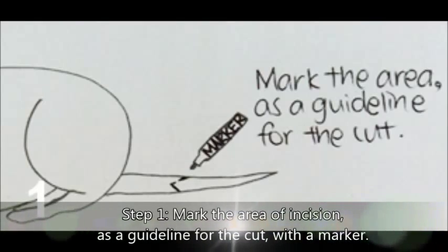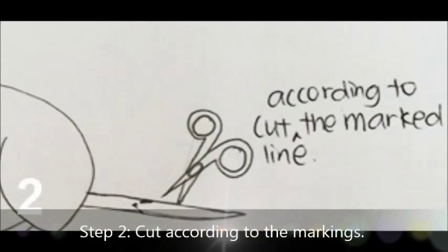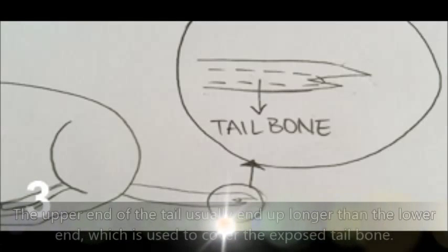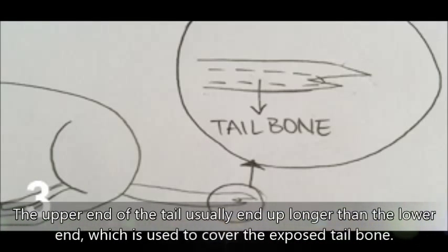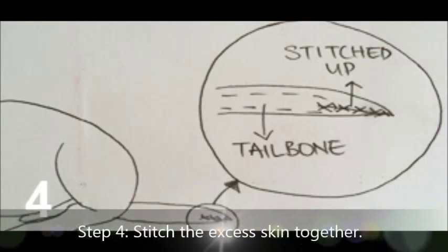V-incision tail amputation method steps: Step 1, mark the area of the incision as a guideline for the cut with a marker. Step 2, cut according to the markings. The upper end of the tail usually ends up longer than the lower end, which is able to cover the exposed tailbone. Lastly, stitch the excess skin together.